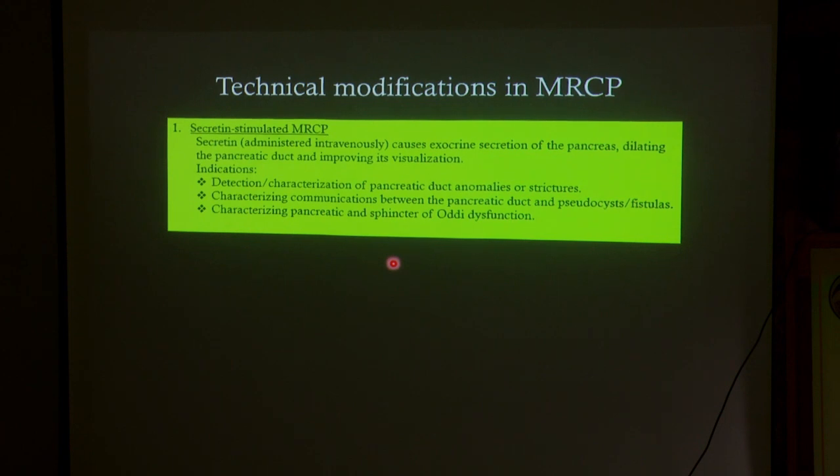So what are the technical modifications in MRCP? One is secretin stimulated MRCP, wherein we give secretin intravenously to visualize the pancreatic duct, which causes increased secretion.